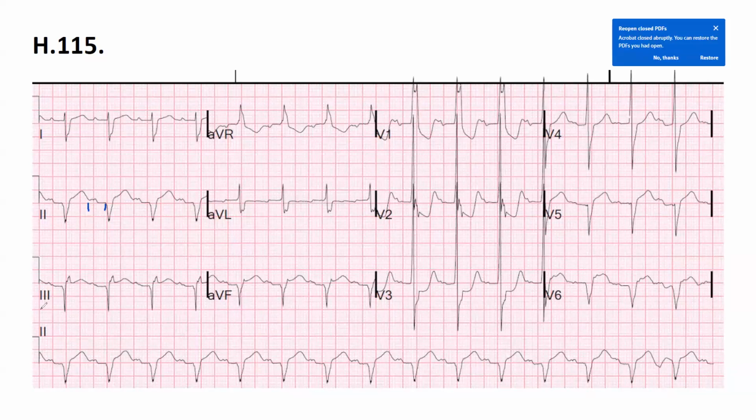What does it mean? We already had this one. Rhythmic sinus P, rhythmic. PR longer, every P followed by QRS. So, oh yeah, I don't know. Yes, you know it. We already discussed it. Anybody?